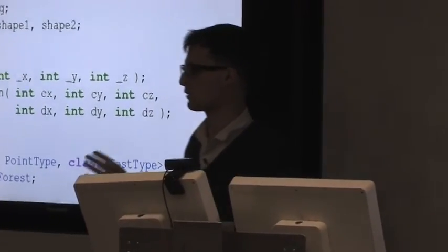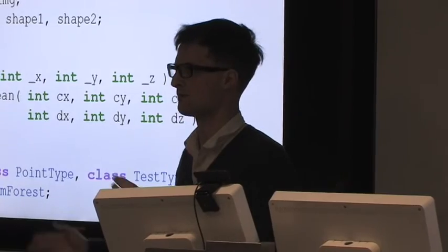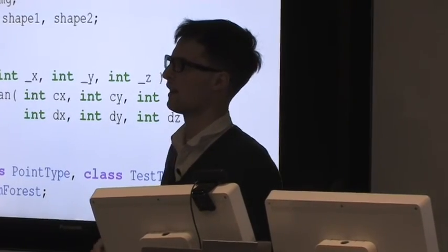That way, you would be computing tests on the fly. Depending on the path that you take down your trees, you would compute a different set of tests.